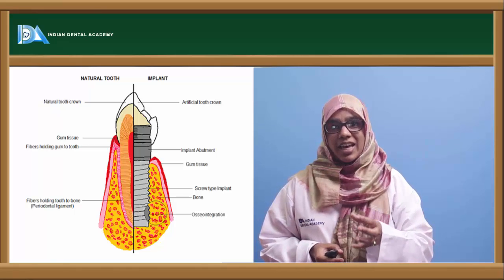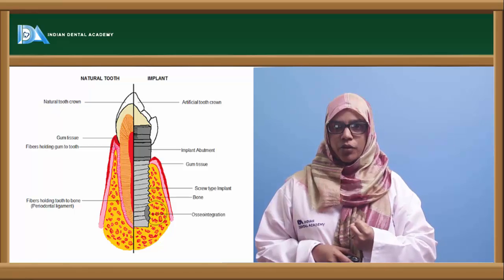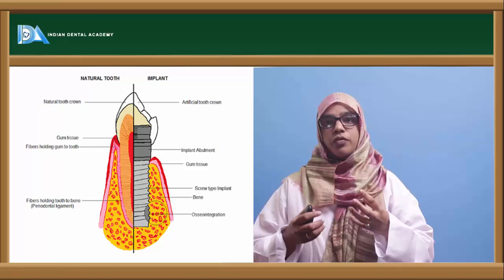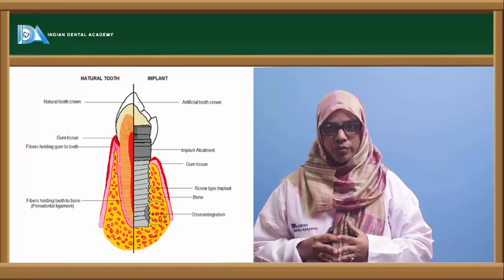Now the implant is actually screwed into the bone. So when masticatory forces are applied onto it, it distributes these forces on the bone. Since the forces are acting on the bone continuously, it doesn't cause resorption of the bone.